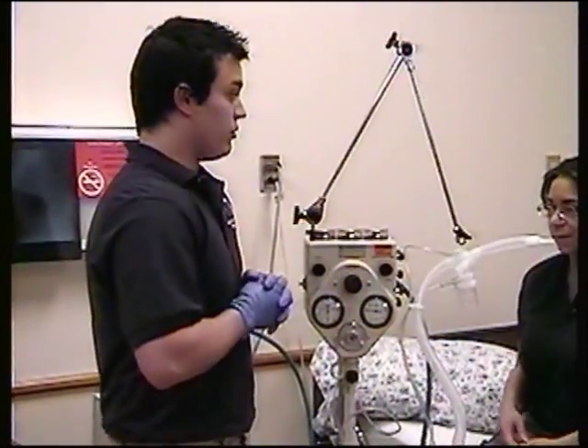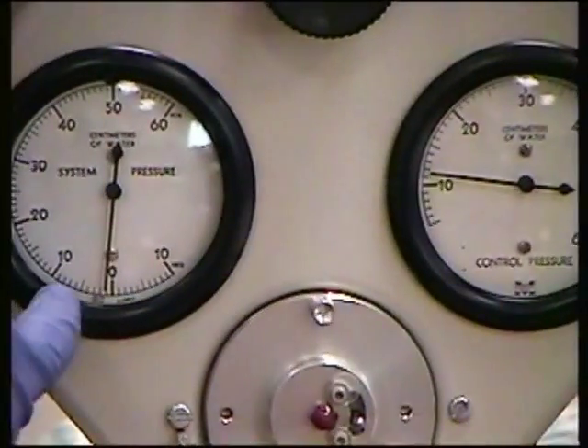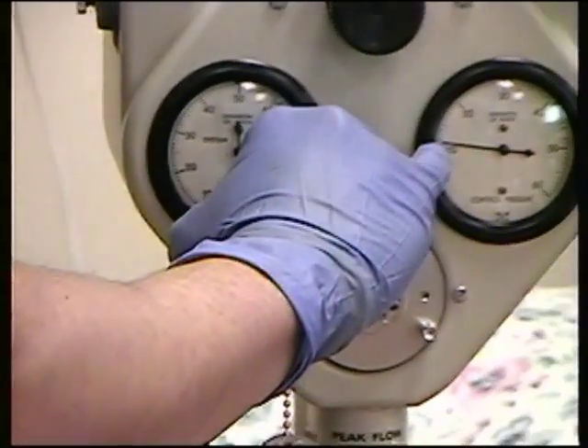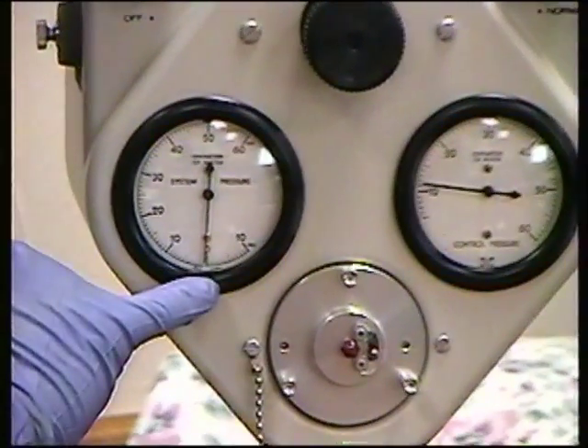I'm going to have my patient breathe in and the pressure is going to rise and going to go back down to baseline level. Our pressure is set at 10 centimeters of water pressure. Notice the dial going to 10 and going back down to baseline.